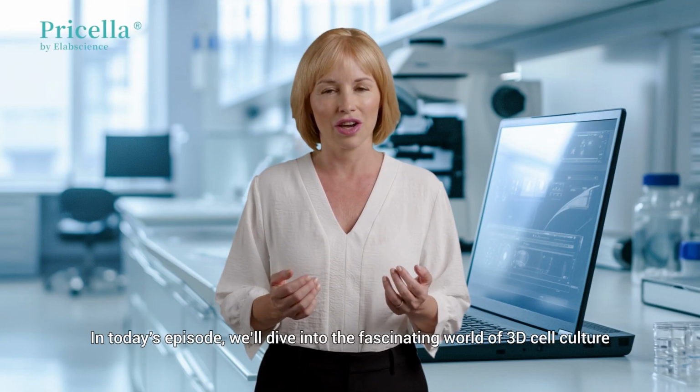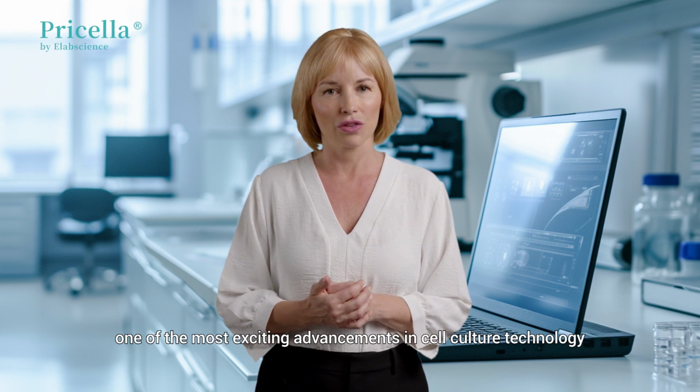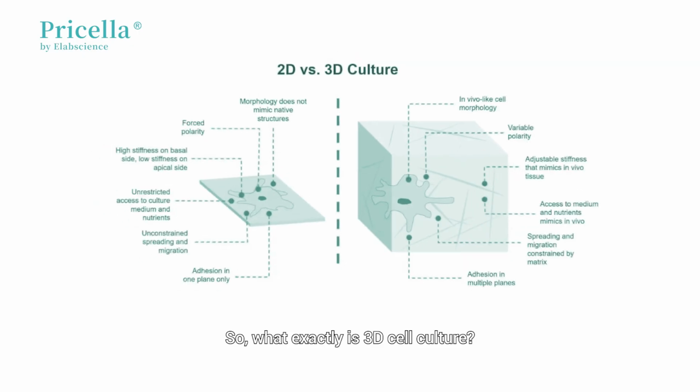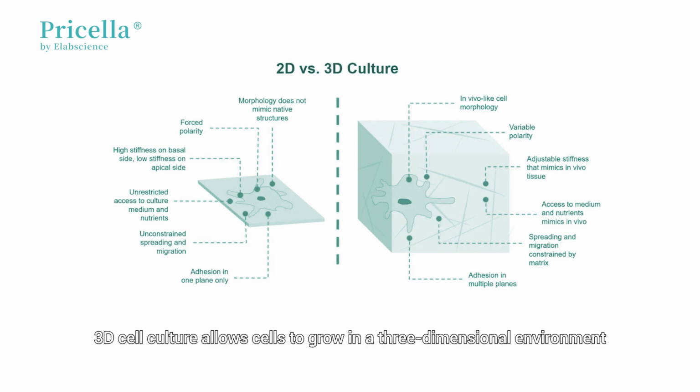In today's episode, we'll dive into the fascinating world of 3D cell culture, one of the most exciting advancements in cell culture technology. So, what exactly is 3D cell culture? Unlike traditional 2D cell culture, which grows cells on flat surfaces like petri dishes, 3D cell culture allows cells to grow in a three-dimensional environment.